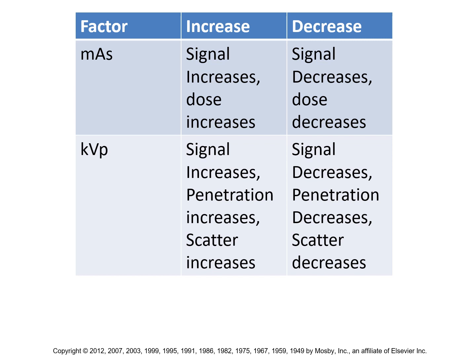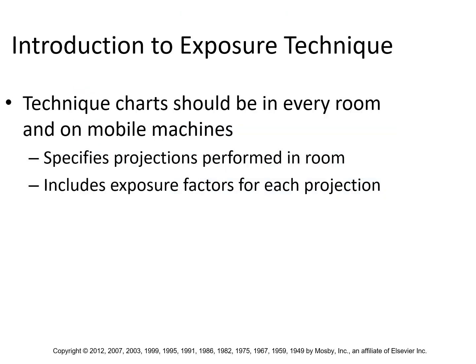The more scatter you generate, the more that noise pattern starts manifesting embedded in your X-ray image. And so with enough of that noise, there are no coherent shapes. You start to lose the ability to identify the anatomy because there's too much distortion and randomness embedded in your image. Okay, so you can't have too much KVP.